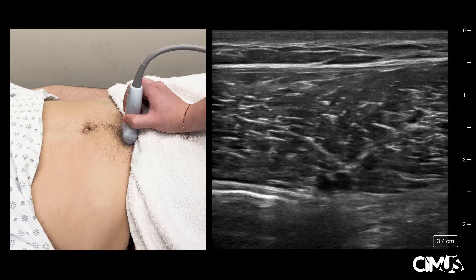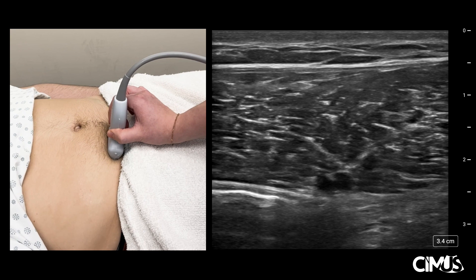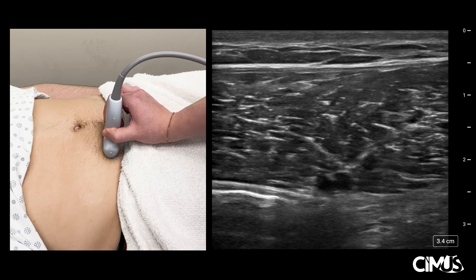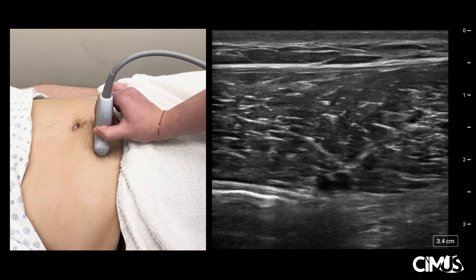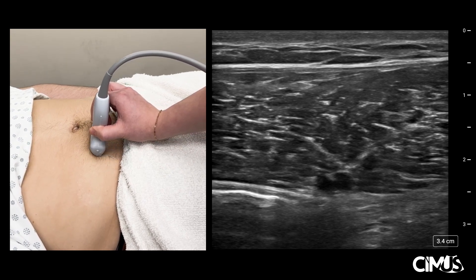With the transducer marker pointing to the patient's right, place the transducer transversely on the abdomen, lateral to the umbilicus, and above the inguinal ligament. Once the vessels are identified, slide the transducer cranially to follow the vessels.